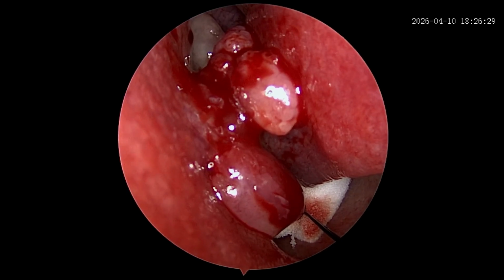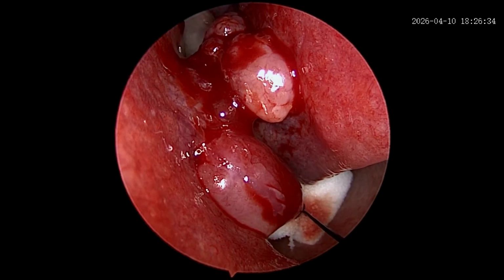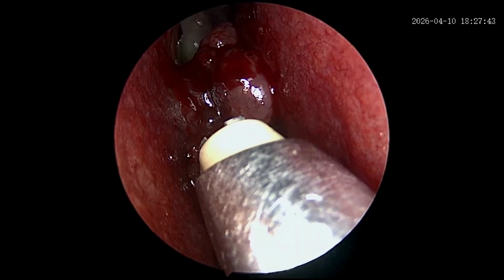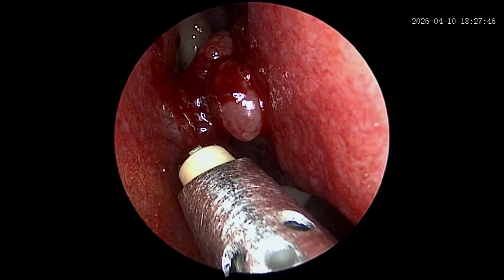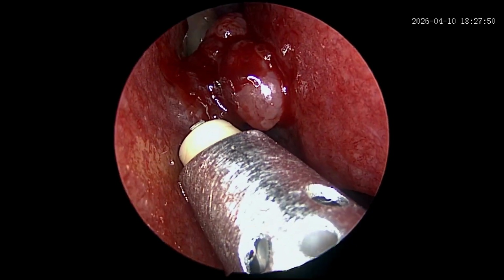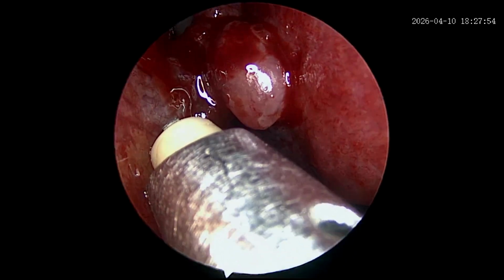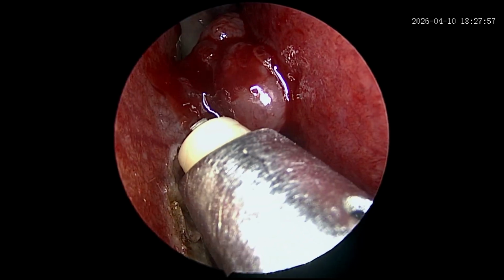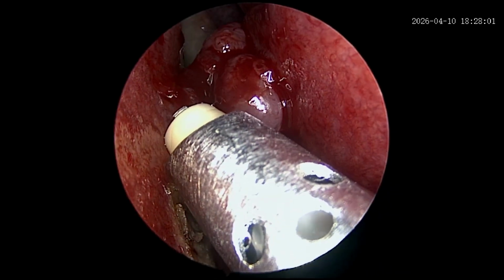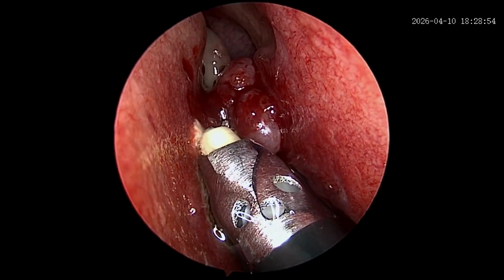We planned for nasal endoscopic excision using a Coblator. So there are two modes in the Coblator, coag mode and the ablation mode. First, we use the coag mode to cut off the blood supply from the nasal septum to the nasal mass. We delineated the attachment and used the coag mode of the Coblator to cut off its blood supply, so it reduces any further chance of bleeding.